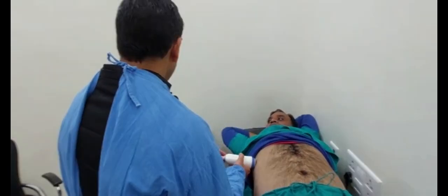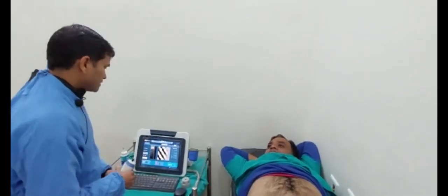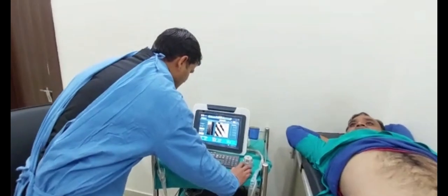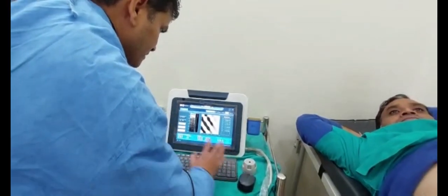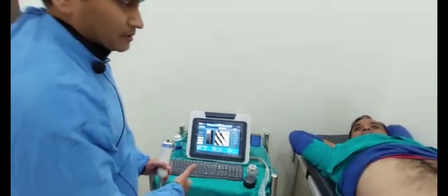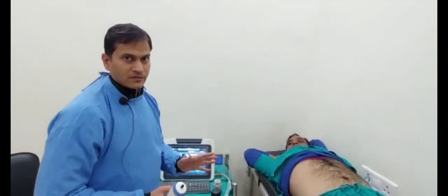We take 10 readings, which takes hardly 1 minute. After this, we can see the readings and the average on the machine, and we can take a printout. This is a very easy and convenient machine for elastography. Thank you.